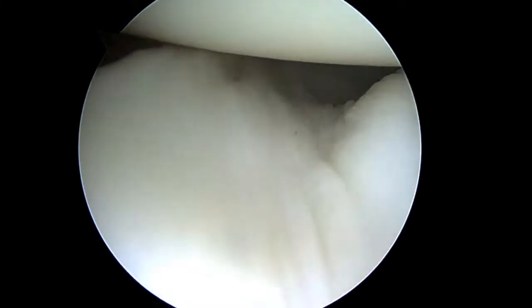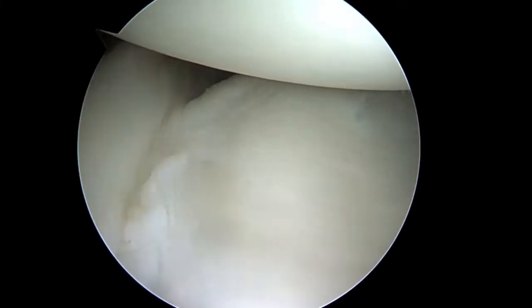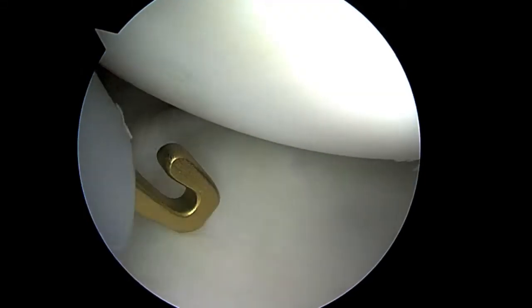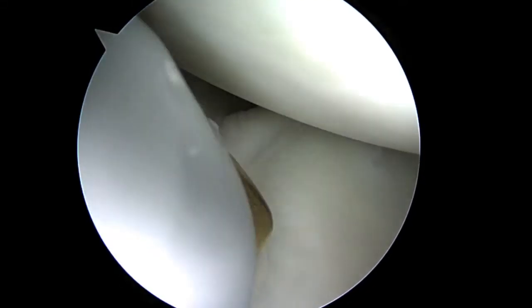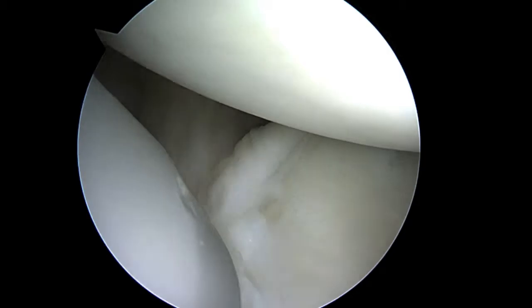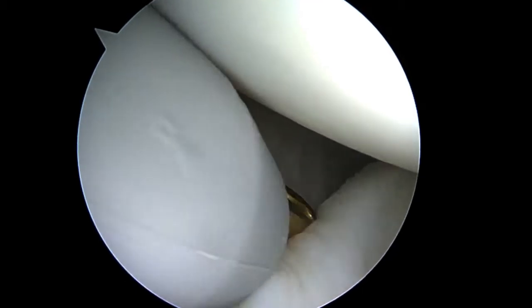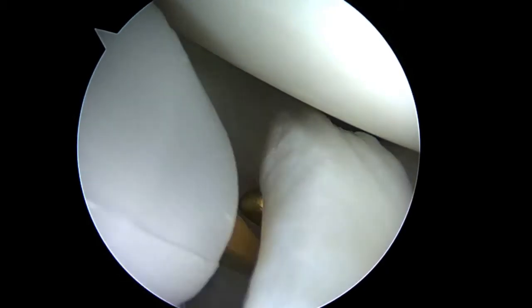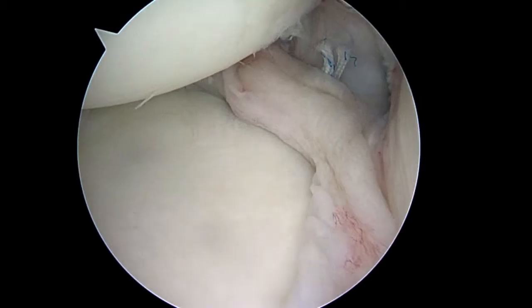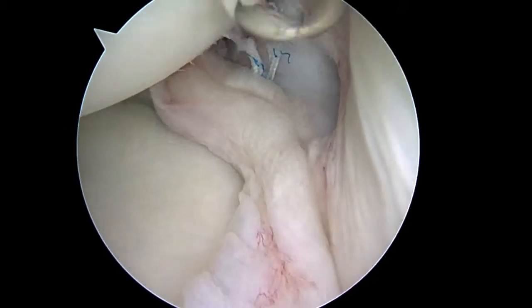We're going to look to the front. And actually, as we look to the front now, that anterior band of the inferior glenohumeral ligament looks pretty good — look at that. So I may not have to do anything in the front. I'm going to have a look around and make that decision in just a minute. We're looking down the front and I just want to check the tension on this band here. I'm pretty happy with that. Desiree, I don't think I'm going to do anything to that — don't want to make it too tight. We've already tightened up the back, which is the main thing we wanted to do. The last thing I'm going to do is place a stitch through this posterior portal just to close it up.